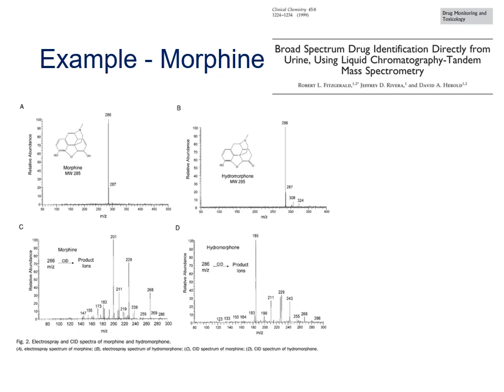In these MS/MS spectra, it's easy for us to distinguish morphine from hydromorphone because the fragment ions produced after fragmentation have different masses. For some compounds, for example stereoisomers, the differences even in the tandem MS spectra can be even more subtle. Very occasionally you'll find molecules where even the fragments have the same masses, and the only way you can distinguish them are subtle differences in the relative intensities of those fragments.